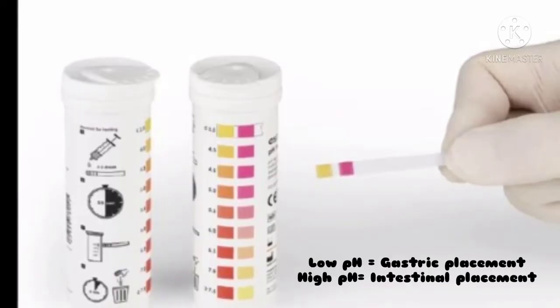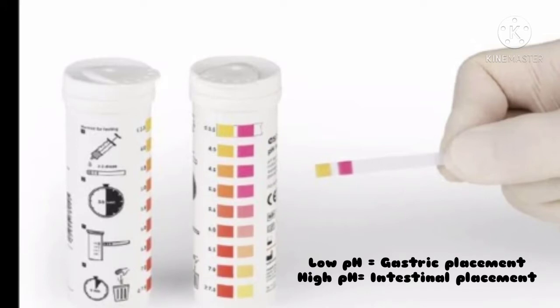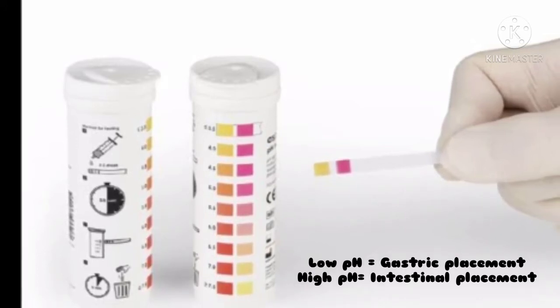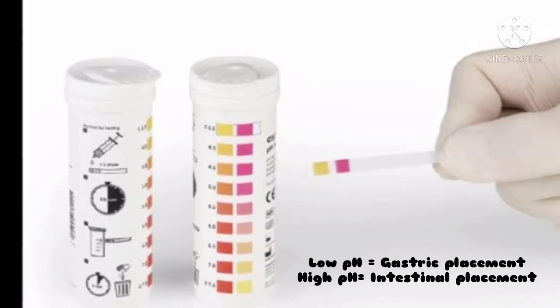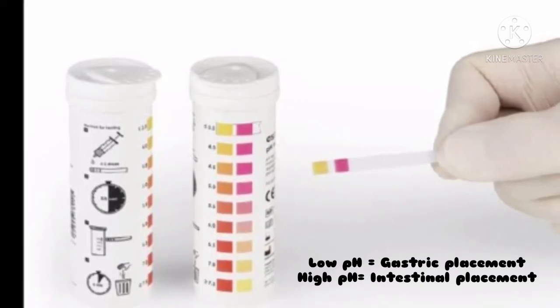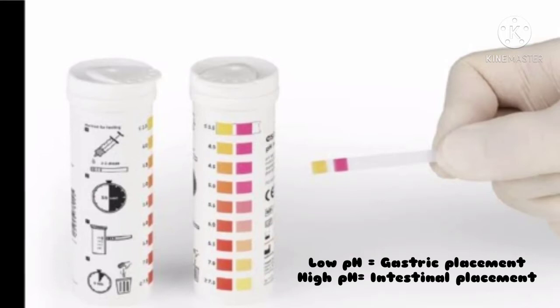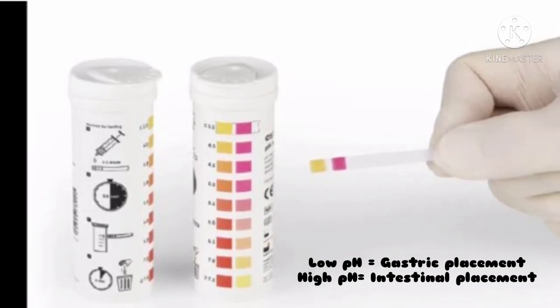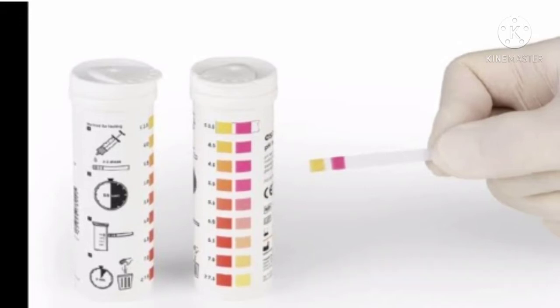Next, we have to consider the results from pH testing and the aspirate's appearance together. An aspirate with a low pH and a typical gastric fluid color indicates a high probability of gastric placement. In contrast, a golden-colored aspirate with a high pH indicates a high probability of intestinal placement.